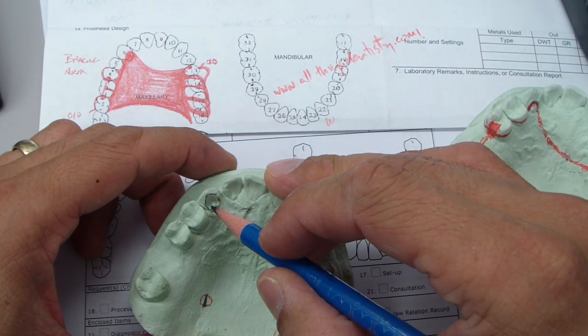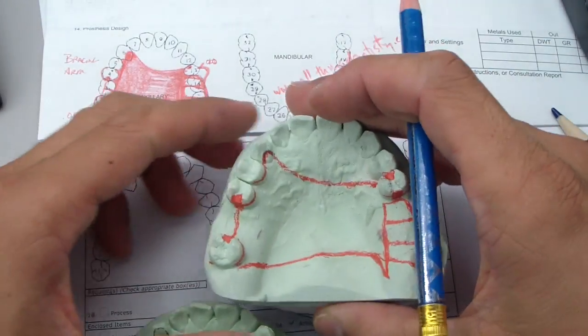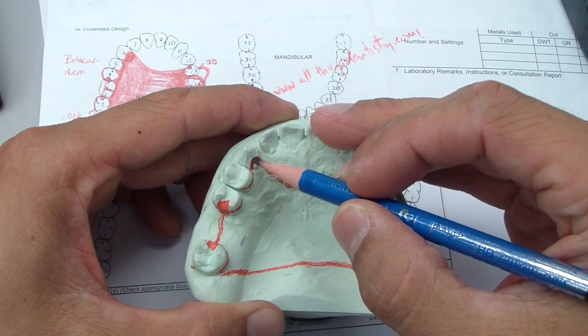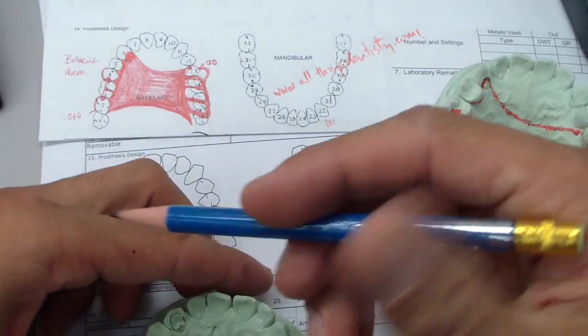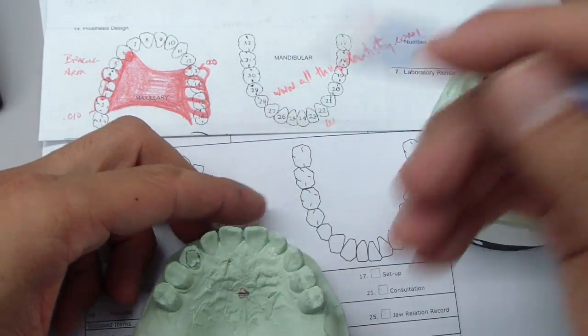Now in hindsight, I probably would have just built this up in composite. You can see the original cast here - built it up in composite and used that just as its rest seat. But here we are, so this is my indirect retainer.